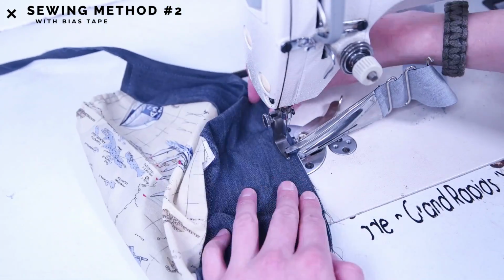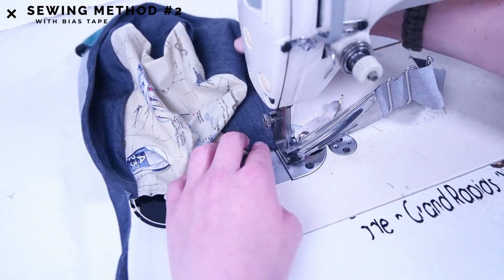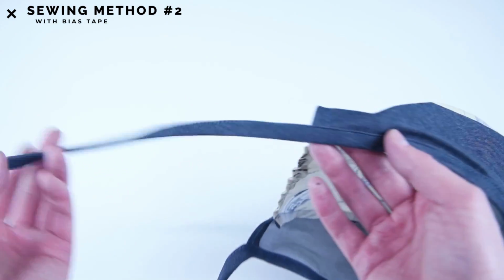This will fold it and sew it on at the same time. And just remember to add 5 to 6 inches before you start sewing, and then sew past 5 to 6 inches. And as you can see, this method is super quick when it comes to making this style of scrub cap.